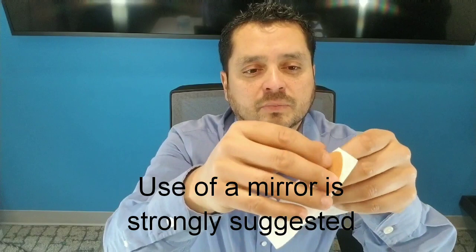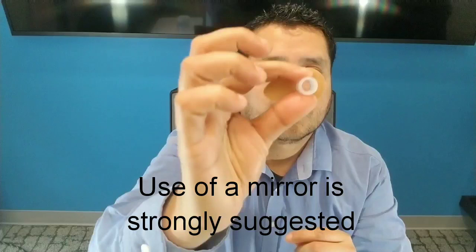Now that your nose is dry, we're going to take the Dreamport and simply peel it off. Please use a mirror when you're doing this. You want this hole to align with your nostril, and what you can do is block off one nostril and test for leaks. Take the next one, same procedure. This is going to overlap right in the middle, and you should be able to breathe in nice and easily. And if you block this off, notice it creates a suction.